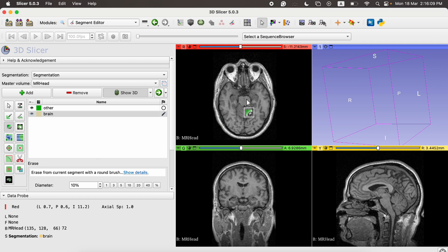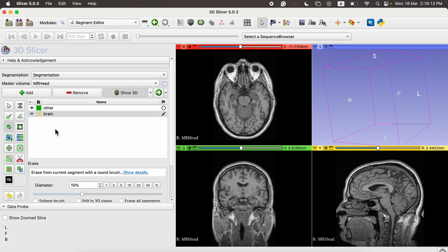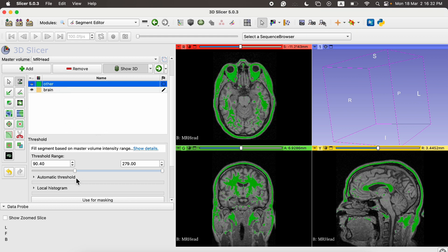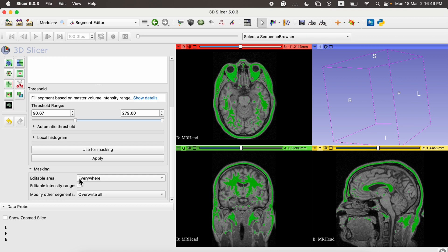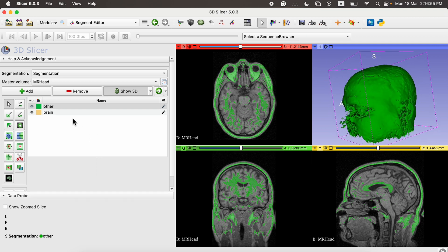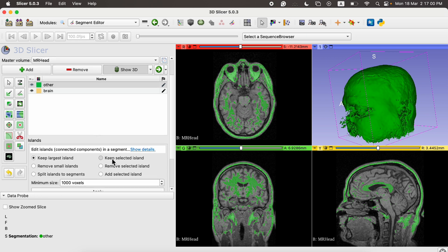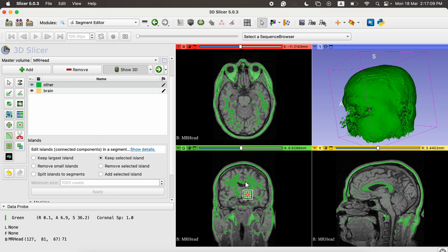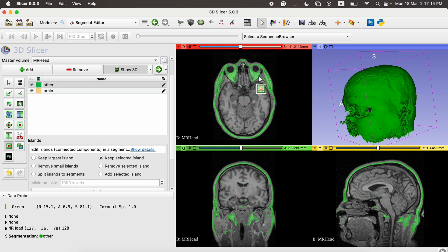Now we move towards semi-automatic segmentation. We have two regions already created. First, click the Threshold button — this lets us set the threshold for the region we want to segment. Click on the 'other' button, then move the bar to adjust the segmentation threshold, and click Apply. Next click the Island button and keep the selected region — we only want to keep the regions outside the brain.